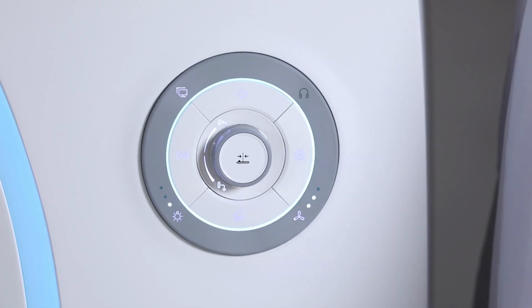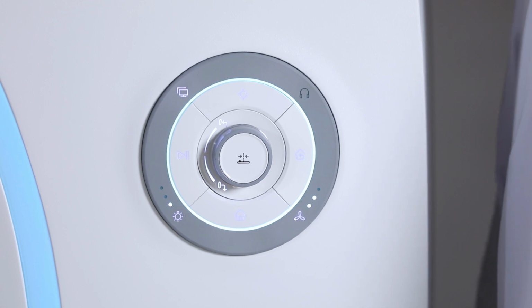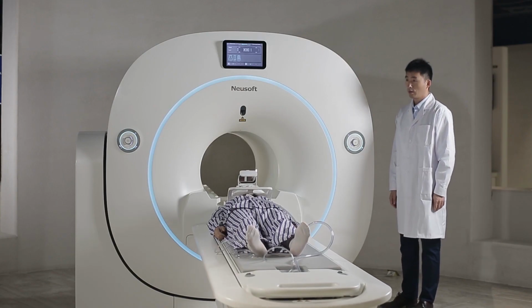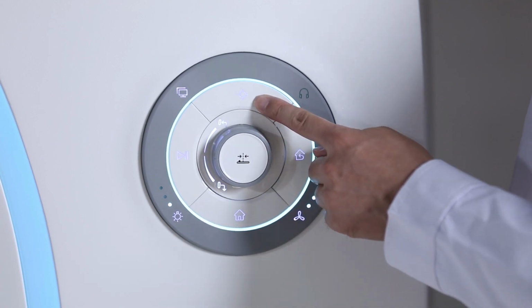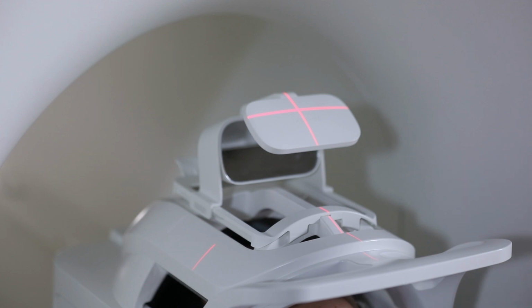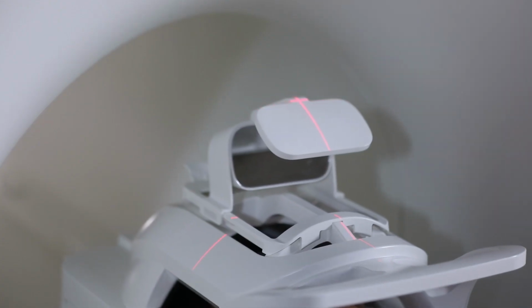Press the home button on the control panel to raise the bed. Turn the knob on the control panel to move the bed towards the laser positioning light. Turn on the laser light. Aim at the center of the coil. Press and hold the mark key to send the head into the center of the magnet to complete positioning.